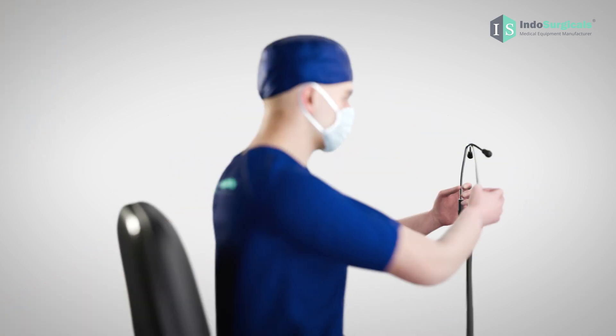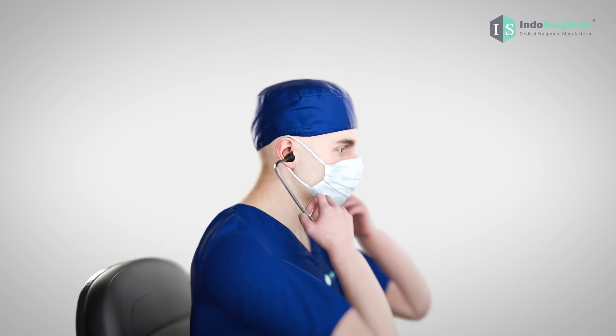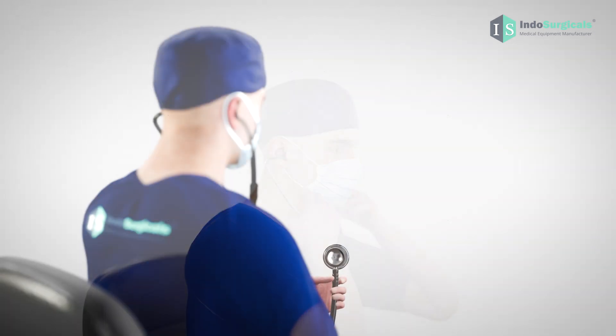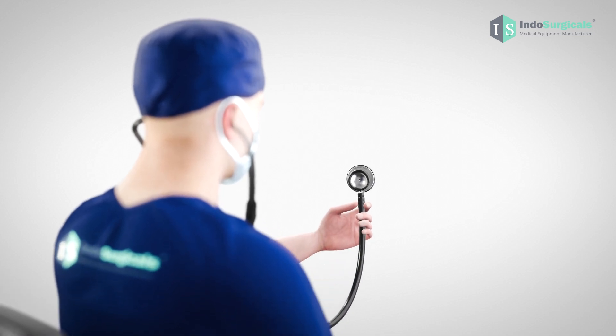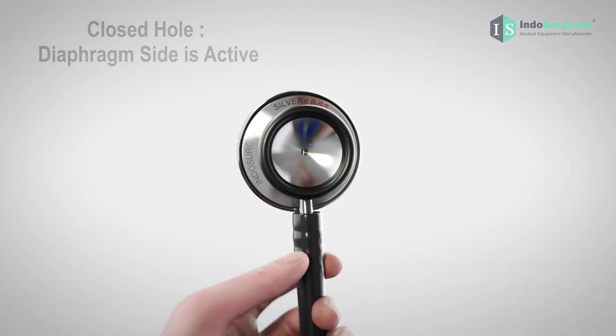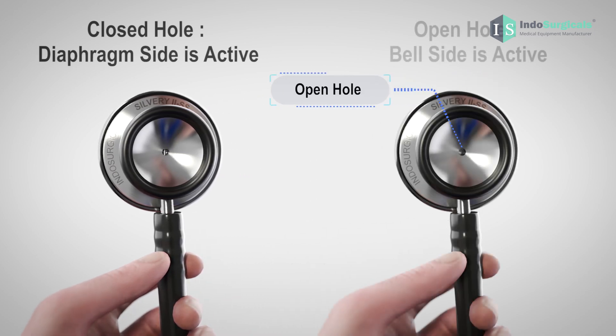The correct orientation ensures clear auscultation and a comfortable experience. Once you have the correct orientation, gently place the ear tips into your ears. To determine whether the diaphragm or bell side is active, look at the chest piece from the top side of the bell. If the hole is closed, it means the diaphragm side is active. If the hole is open, it means the bell side is active.